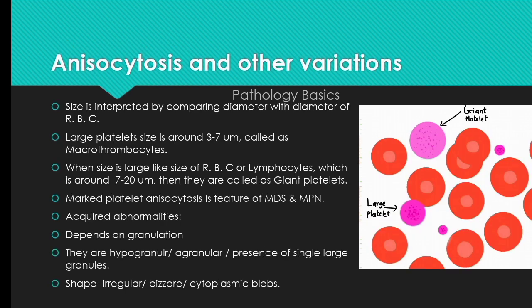Now we learn about anisocytosis and other variations. These small pinkish dot-like cells in between RBCs are platelets. Platelet size is interpreted by comparing the diameter of the platelet with the diameter of the RBC. The large platelet size is around 3 to 7 microns, which is also called macrothrombocytes.